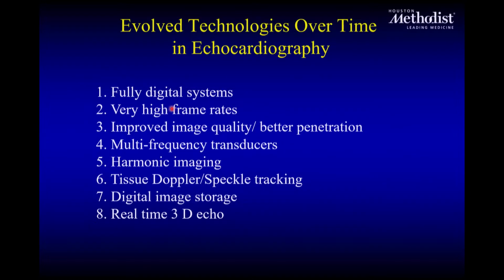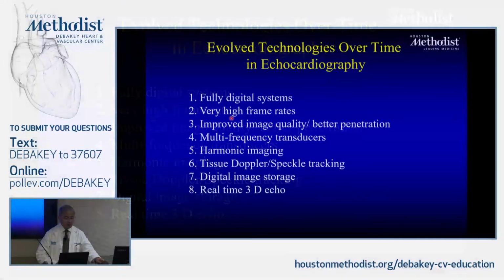So over the years, and I don't know if Mike Quinones is here, but obviously he's seen even more than I have, but I've actually lived all these stages, okay? We didn't have fully digital systems. We had mechanical systems first. We have very high frame rates now with parallel processing. Much better quality transducers are amazing nowadays. Multi-frequency transducers in the old days, and some of the sonographers who have more mileage than others.